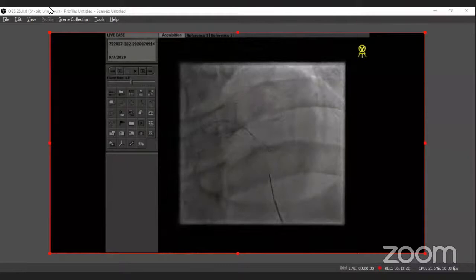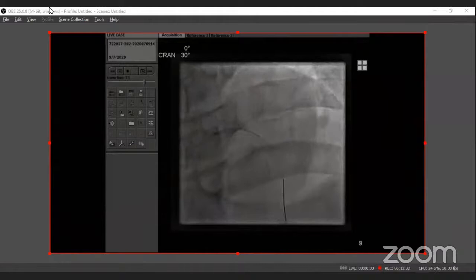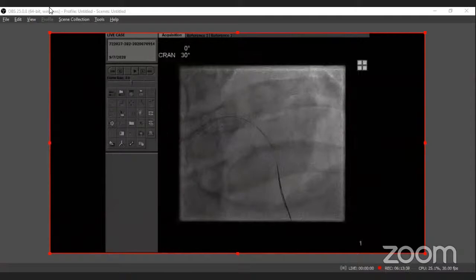So Aaron, may I have the 3.0, please? We'll watch you finish up the case first. We use a 3.0 NC balloon first. So you can put the stent in now, but the thing is, sometimes it's not well dilated, so the stent may get caught there. So we're going to use a 3.0 NC balloon to open the stent struts.